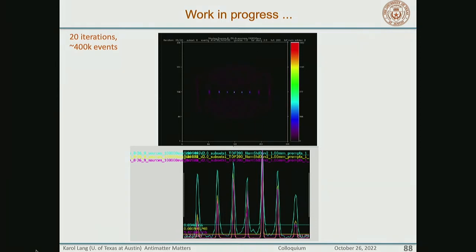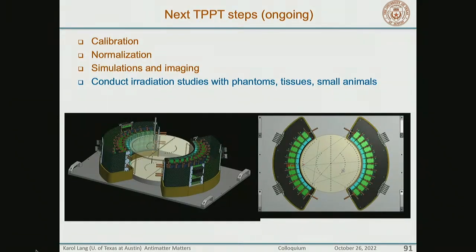these positions. And they're about close to 2 millimeters precision, which is, again, if you go to commercial scanners, much better than what industry has. So our next step is really to fully calibrate this and fully certify it before we move it to MD Anderson, where we'll conduct all kinds of tests.